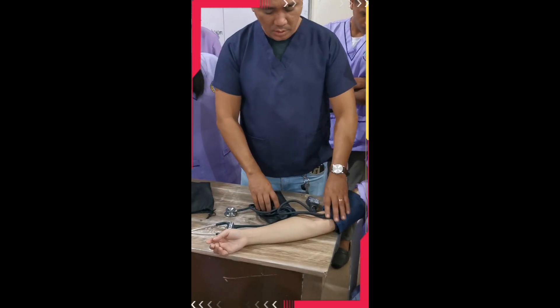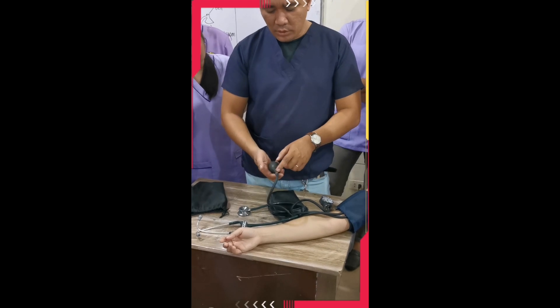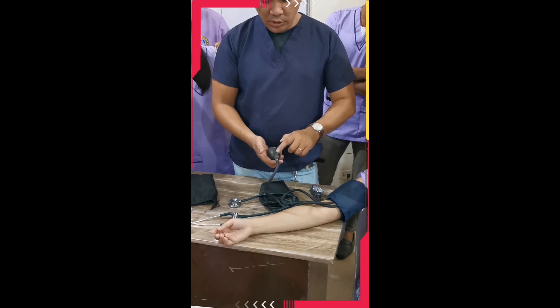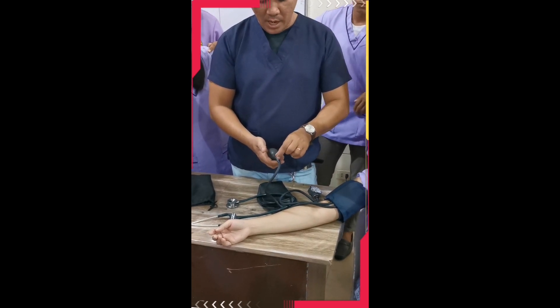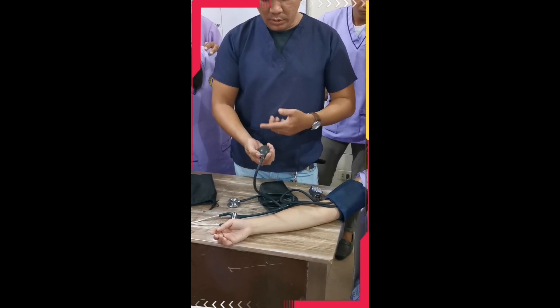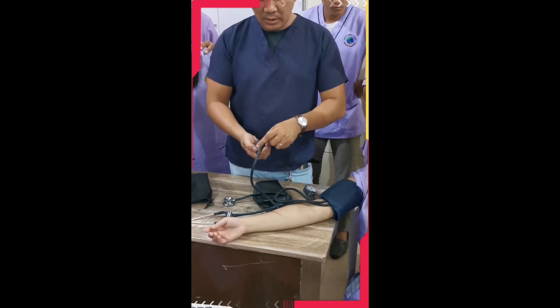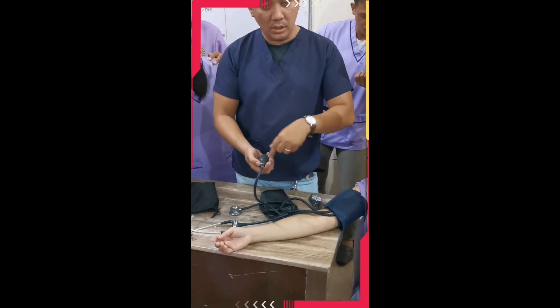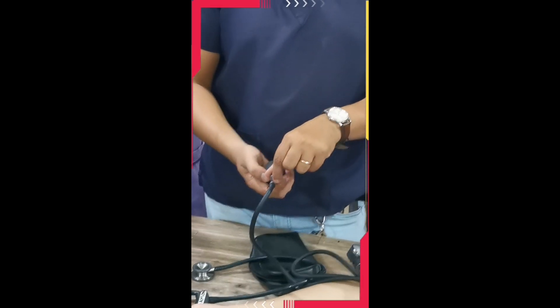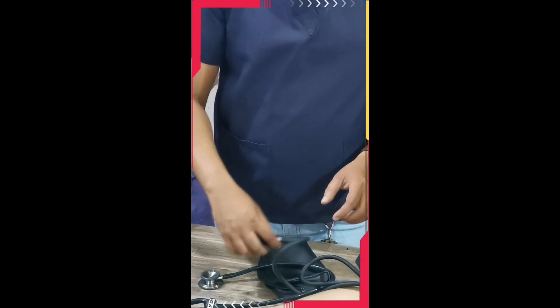Once the BP cuff is ready, attend to the other side of the tube where you have the air release valve and the inflation valve. Before taking the BP, make sure to lock the air release valve. To lock it, turn the air release valve clockwise — going to the right — until it is fully locked. This means it is ready to be inflated.